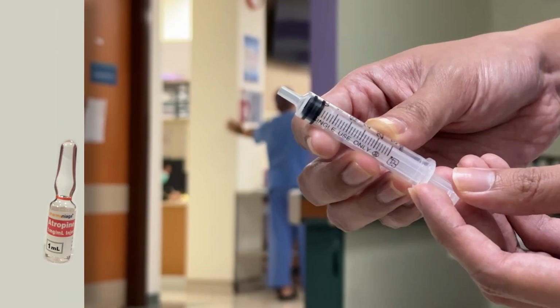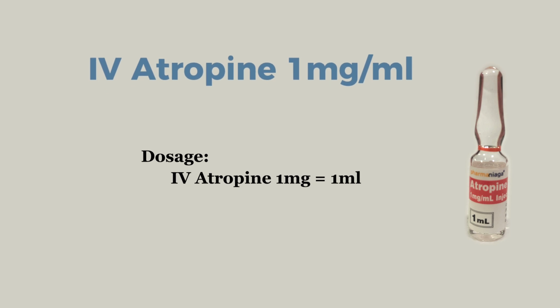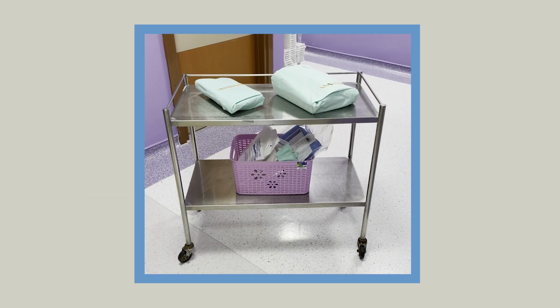IV atropine does not need to be diluted, prepared in the syringe as it is, or as we usually call it, pure. There are some other medications that might be needed in angiogram. Refer to your facility protocol if you need it. Next, the sets for the procedure.